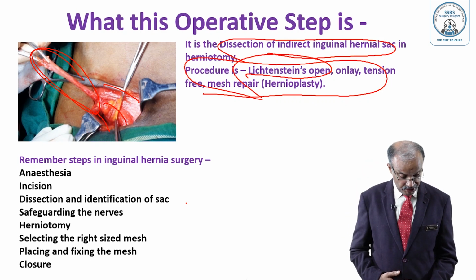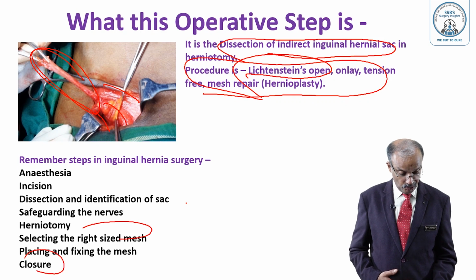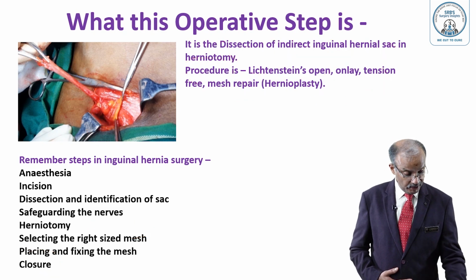Herniotomy, selection of the right-sized mesh, I said, placing and fixing, closure. All these steps I already explained. You take a note of it.